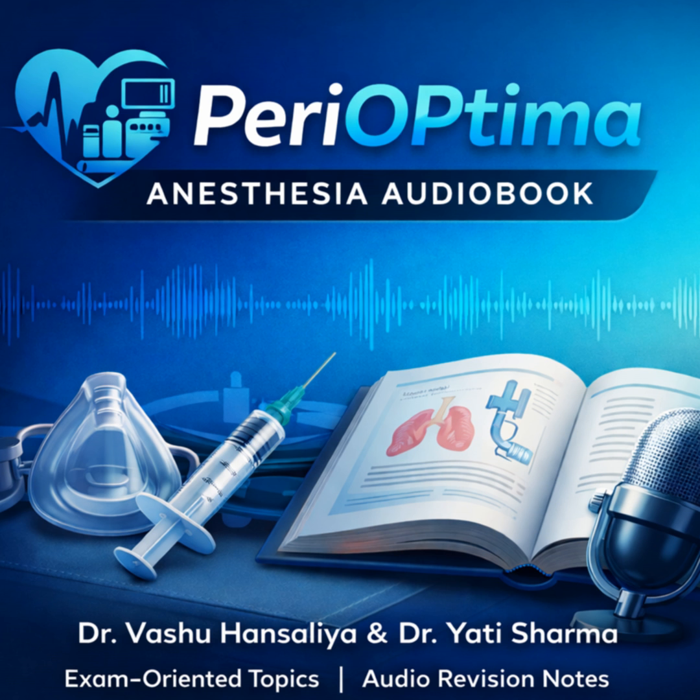Correct. And here is the secret sauce for the exam, the thing you have to understand. The ventilator cannot control everything. The equation forces a trade-off. A trade-off. Yes. This leads directly to the big two control variables that define almost every mode. You can choose to control the volume part of the equation, or you can choose to control the pressure part. But you can't control both at the same time. Why not? Well, think about it.